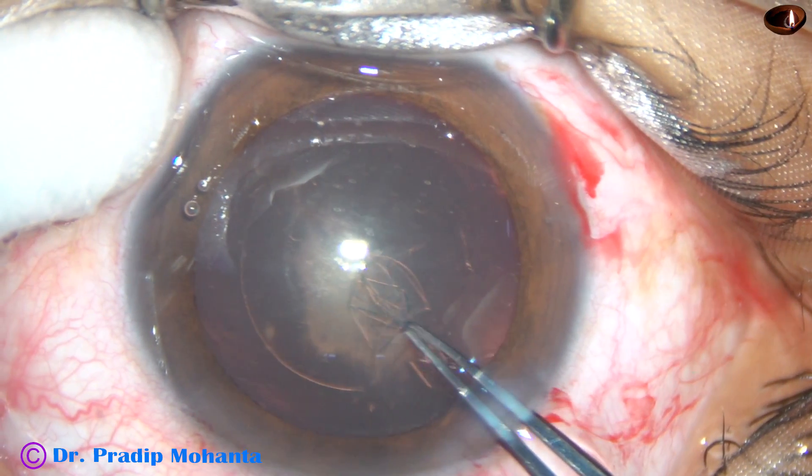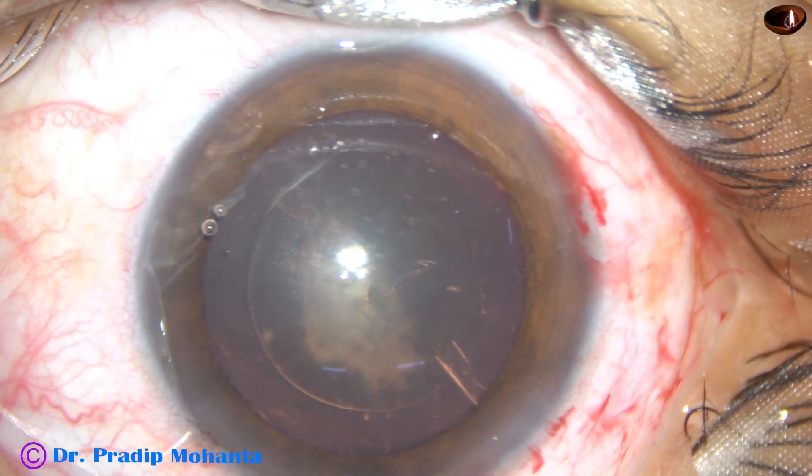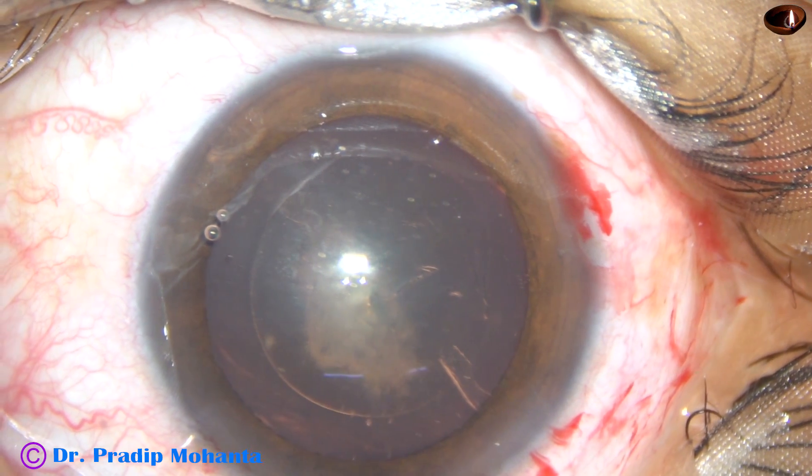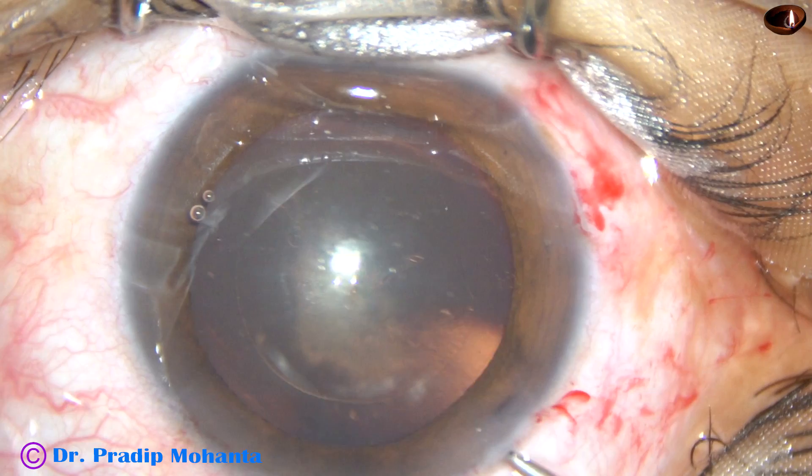Try to make this a circular opening. It may not be circular all the time, but if you practice, most of the time you will get a fairly round capsulorrhexis. And now hydrodissection is to be done.